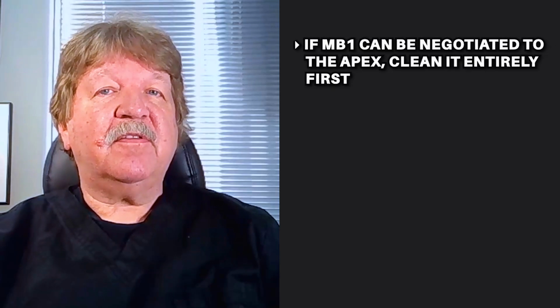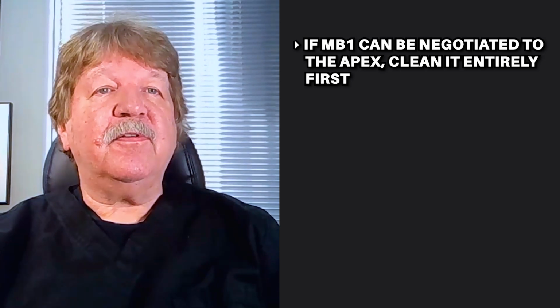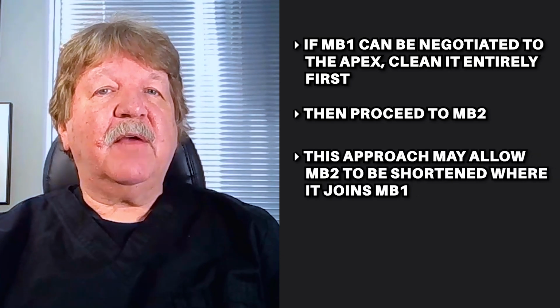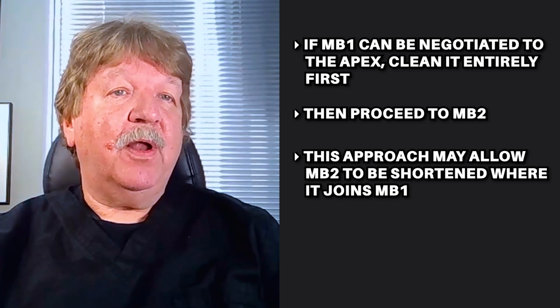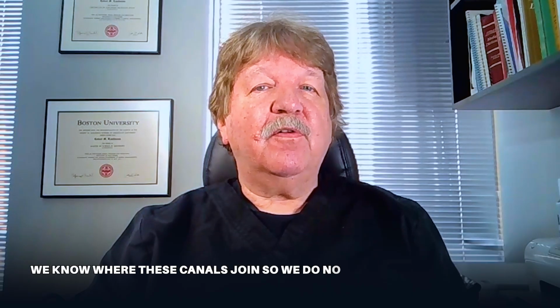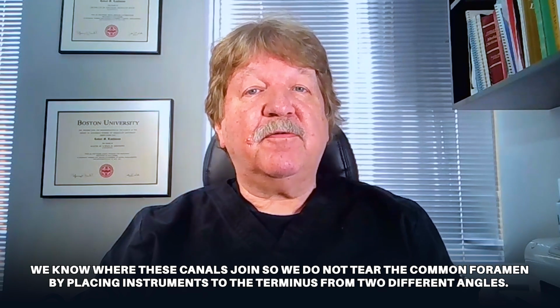If MB1 can successfully be negotiated to the apex, I prefer to clean this canal entirely first and then move on to MB2 last. The advantage of doing this is that we can occasionally shorten MB2 where it joins MB1. Shorter canals are usually easier to treat and negotiate. Check out my other video on how to determine whether MB1 and MB2 are joined and how to figure out where they're joined. It's imperative that we know where these canals join so we do not tear the common foramen by placing instruments to the terminus from 2 different angles.